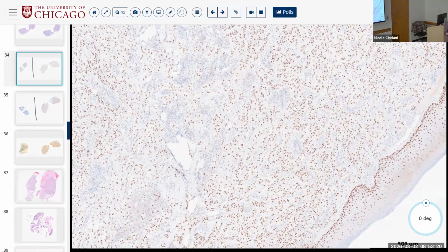You can get myoepithelial tumors of somatic soft tissue, in which case keratins can be very helpful to show that these are myoepithelial. When you're in a salivary site and you know you're dealing with something epithelial or myoepithelial, I don't tend to need a keratin. However, by definition, something myoepithelial should have keratin and the other markers. Just to put that out there.